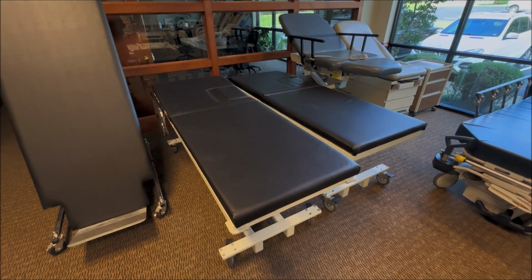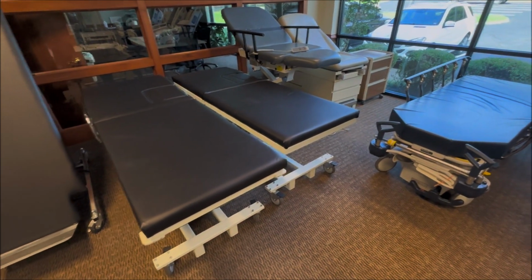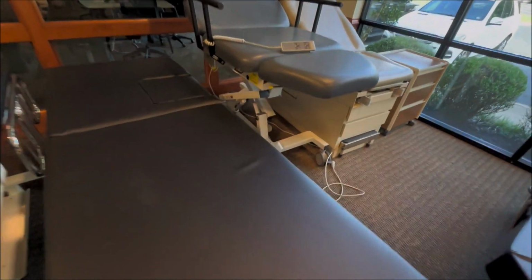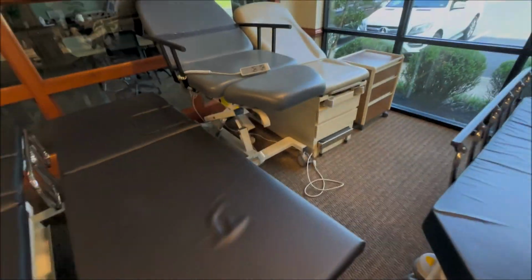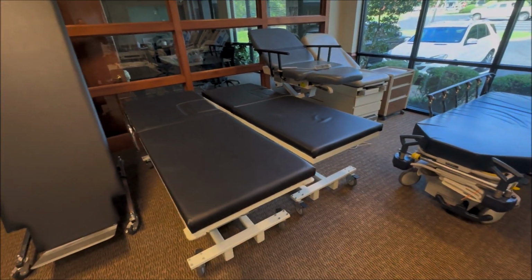Depending on what it is that you need, if it's OB/GYN, which we're not really covering in this video, but something like this right here, it would have pull-out stirrups. This actually does have pull-out stirrups. So we can see right here that we've got stirrups that come out, that this one actually does have the OB/GYN functionality.